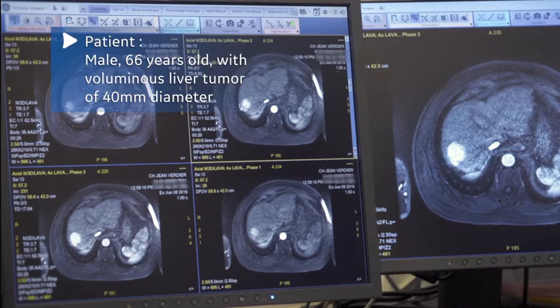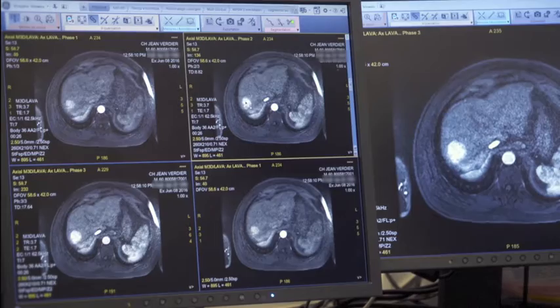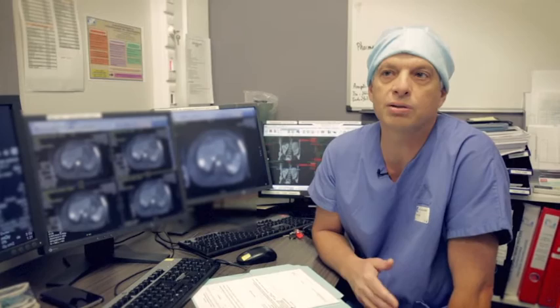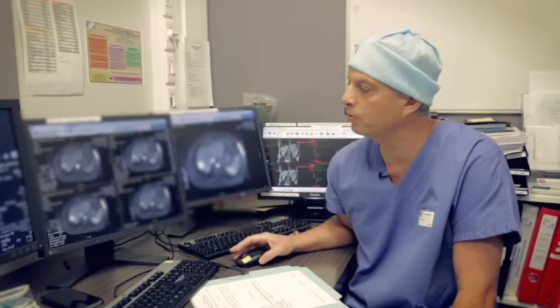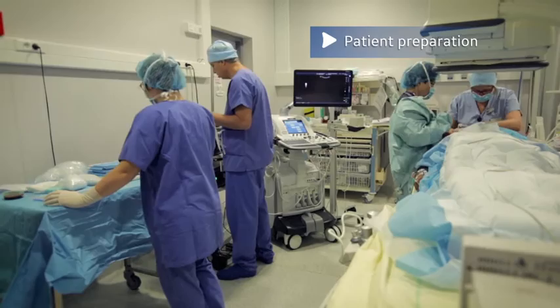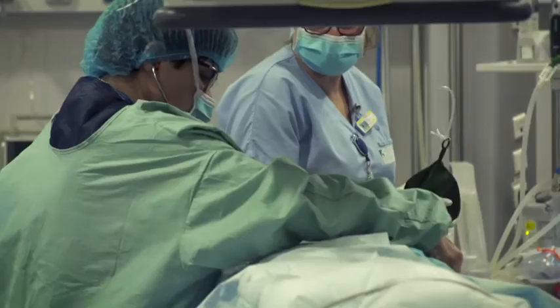This patient has developed a tumor larger than 40 millimeters in diameter with satellite nodules that are not well-confined, located in an area of the liver that with the standard technique would require surgery — a resection of the liver that would be much too large, so large that the patient would not withstand it. Ablation techniques are usually selected for tumors of less than 3 centimeters and are rarely used for larger tumors because they often fail.